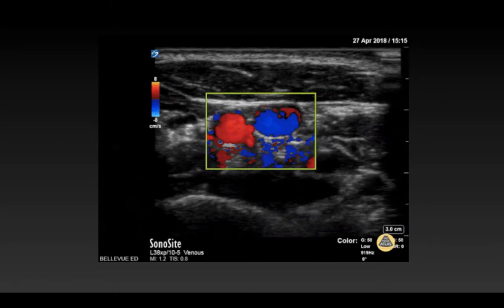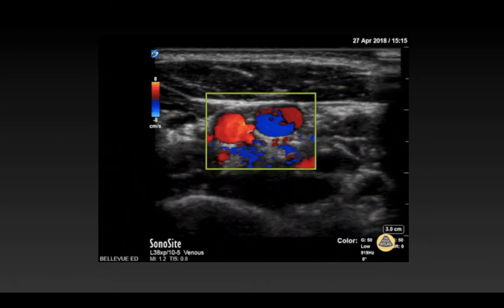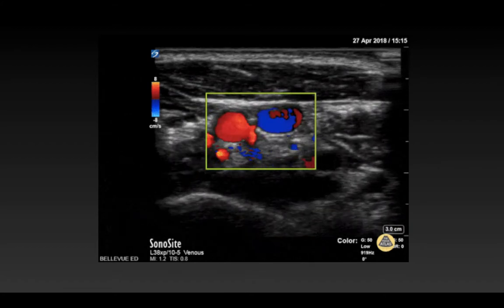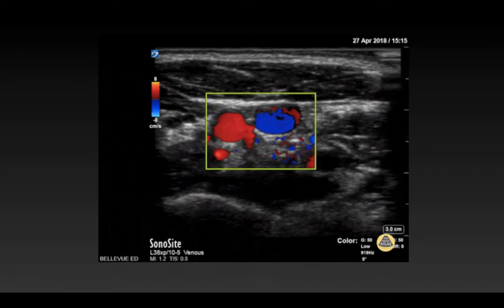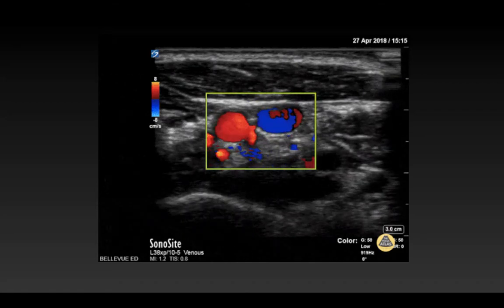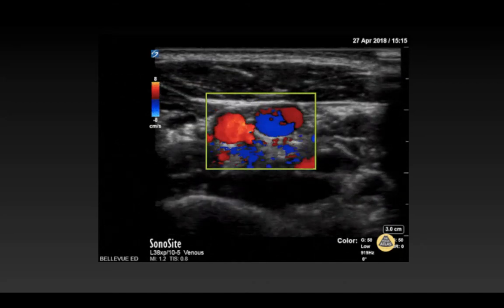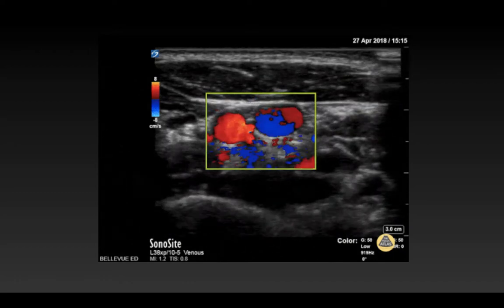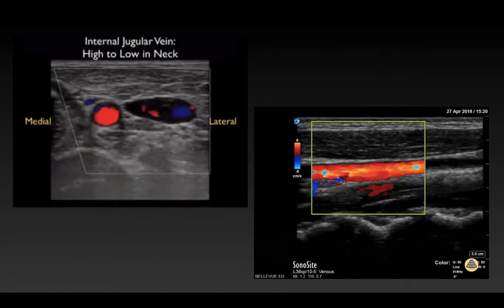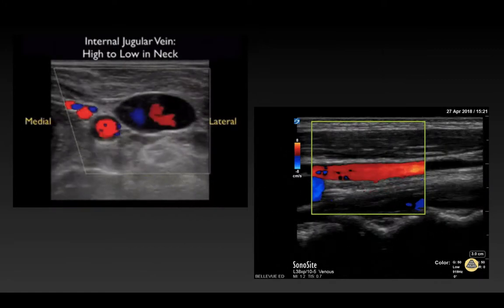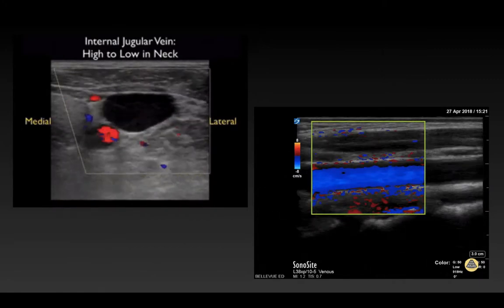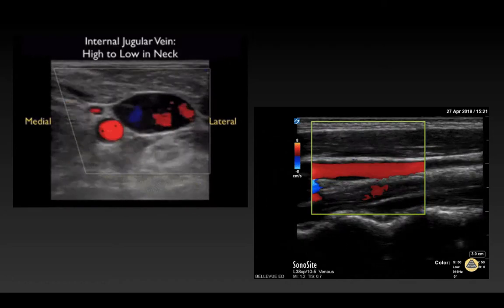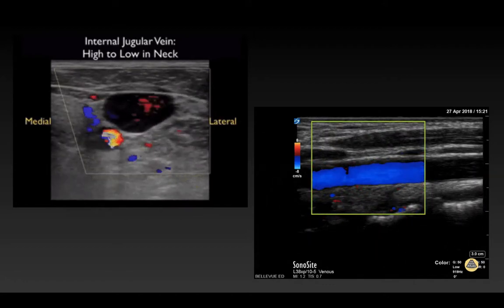Here, you can see the provider is using a transverse view of the internal jugular vein with color Doppler. On the left side of the screen is the high-flow, thick-walled carotid artery, and on the right side, your thinner-walled internal jugular vein. You want to take your probe and scan from high to low, low to high, assessing the path of the vessel and evaluating for any abnormal anatomy.